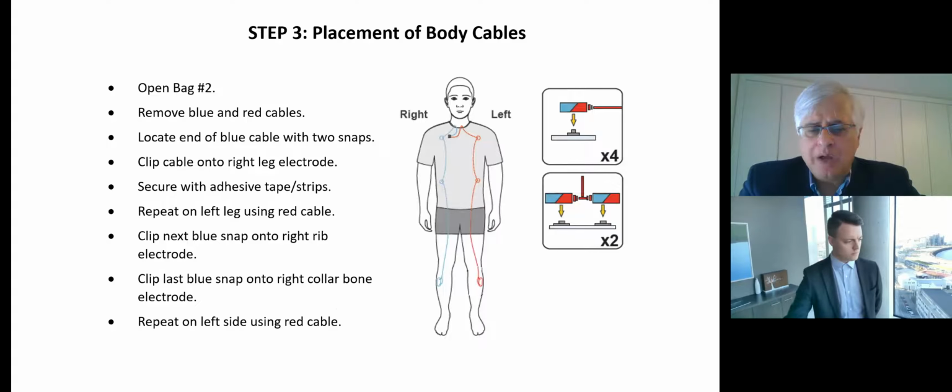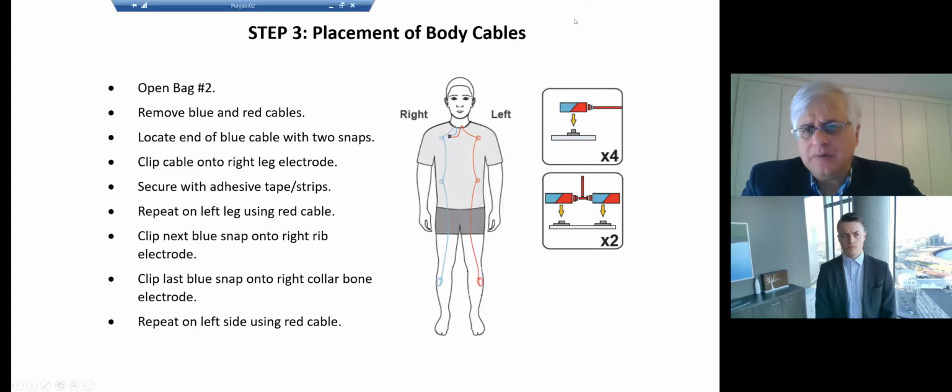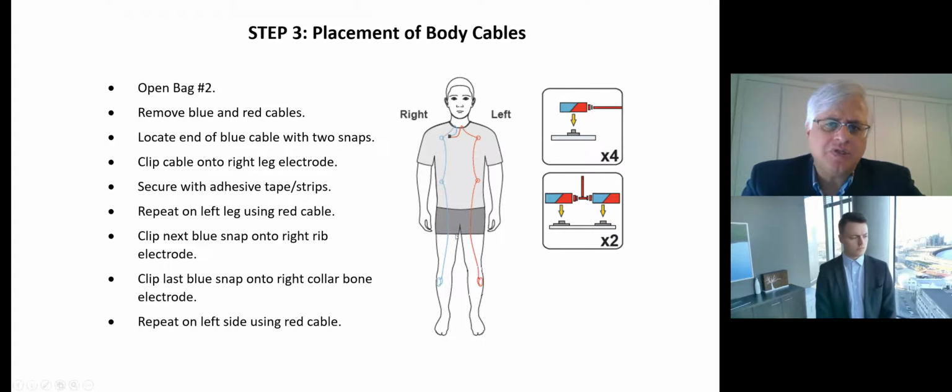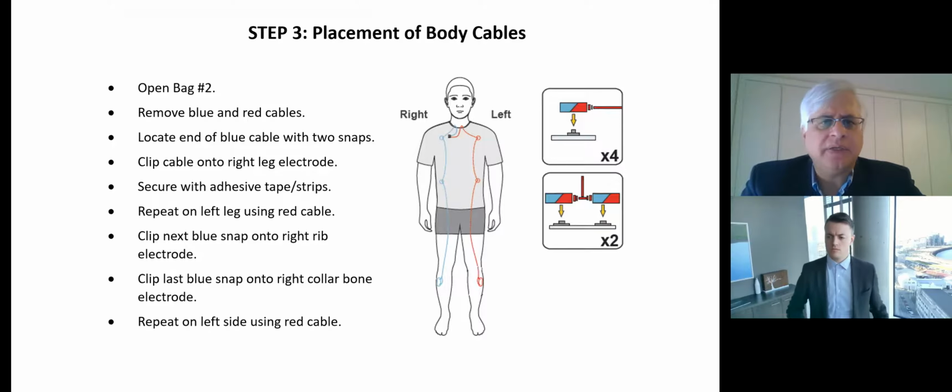And we're able to walk them through how these cables should be routed, whether it's an undershirt or nightgown. We tell them how to clip on, of course, the cables to the electrodes and how they should be routed under the garments that they wear for the night.